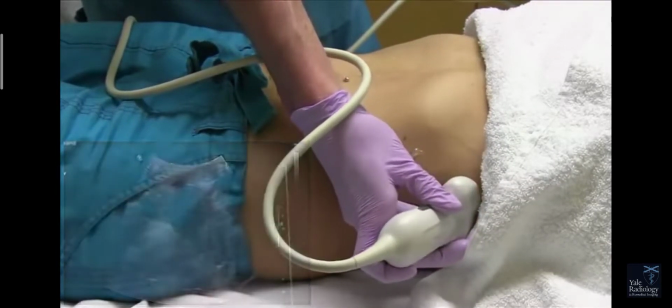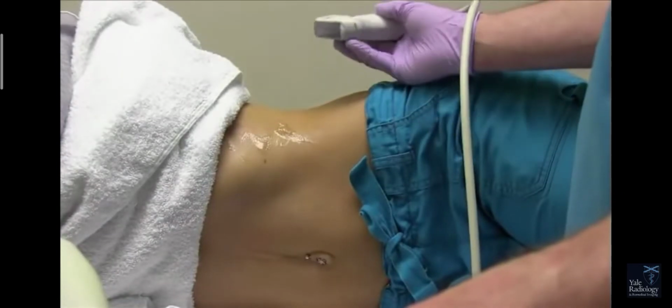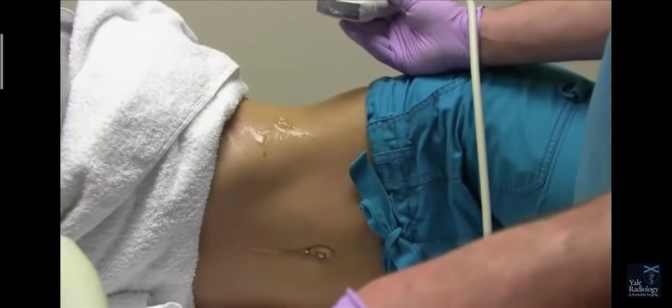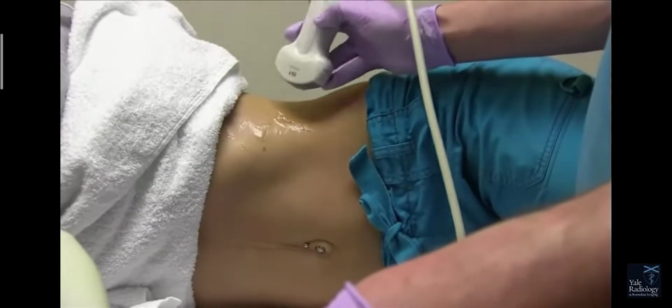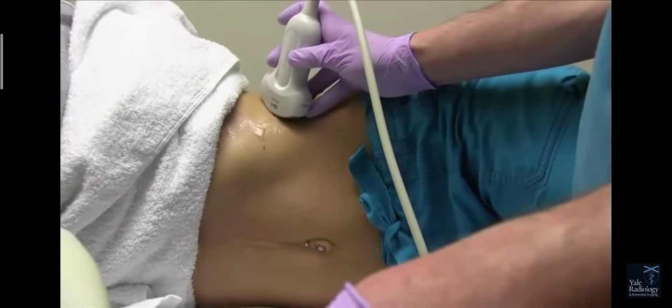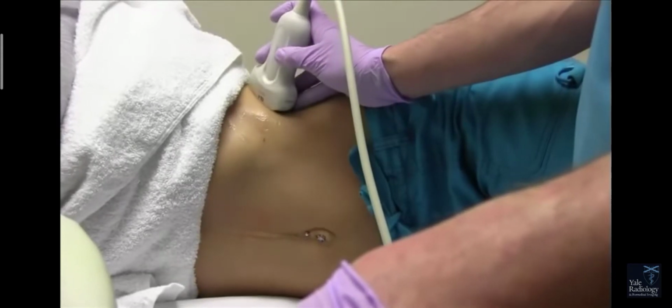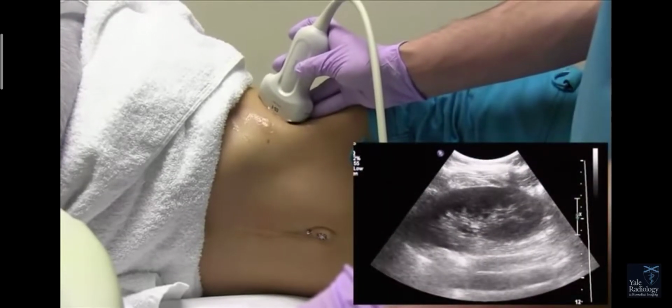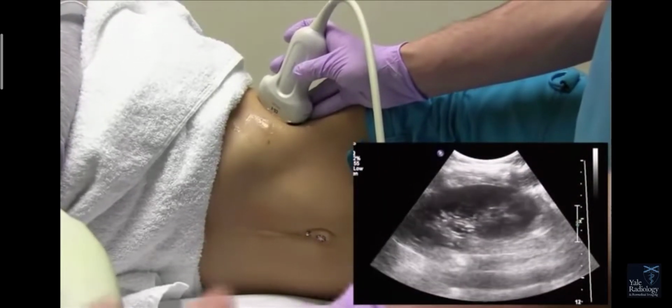To image the left kidney, we usually have the patient turn up into a right decubitus so they're facing you. And the important thing to remember for the kidneys is the upper pole of the kidney is going to be slightly more posterior.